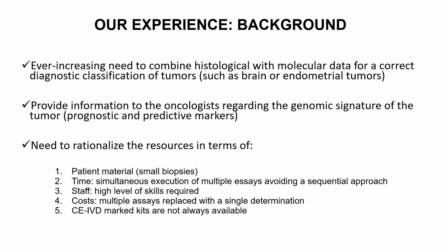Then, providing oncologists with information on the genomic signature of tumors, prognostic and predictive markers. So, NGS provides valuable insights into the genetic mutations, copy number alterations, and other genomic features of tumors. This information helps oncologists in predicting disease progression, prognosis, and selecting personalized therapies tailored to the molecular profile of each patient's tumor.